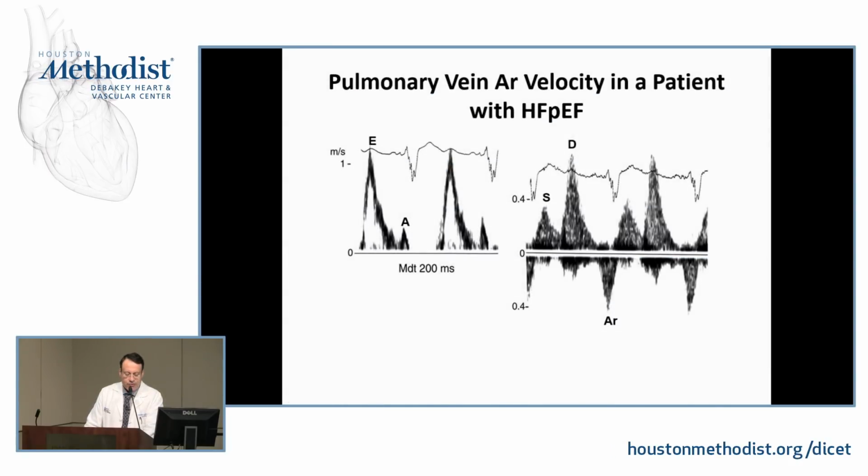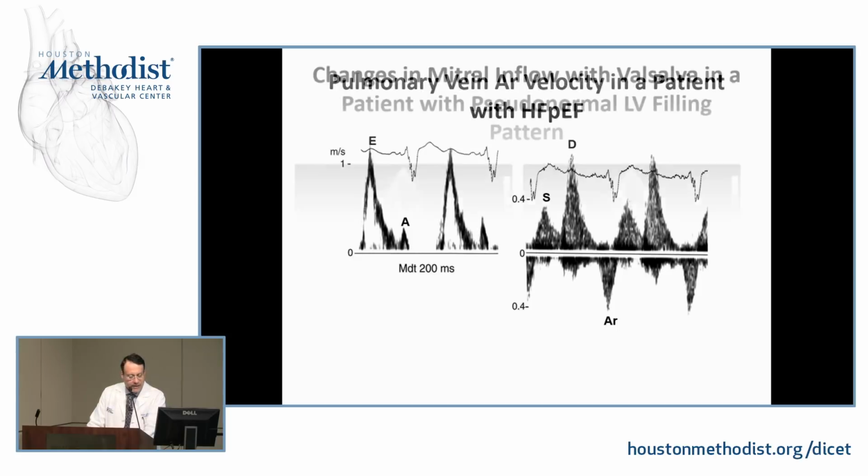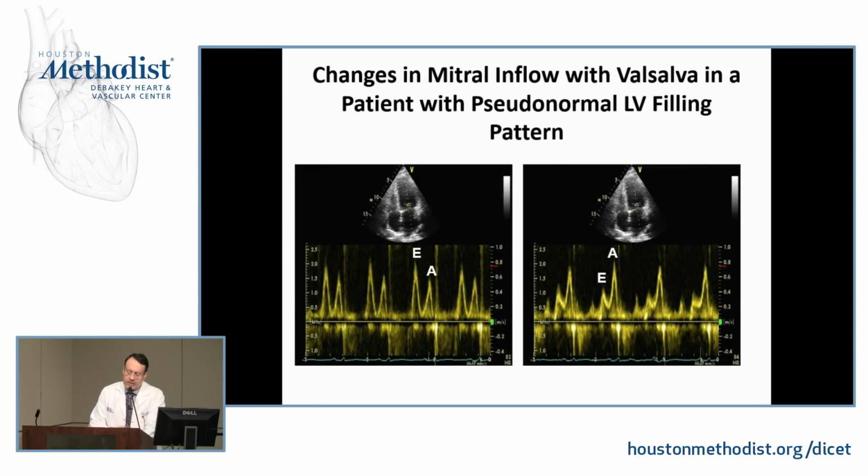How feasible is it to get these velocities if you spend enough time, particularly in the outpatient setting? The consensus of what is published in the literature from reputable labs is in excess of 80%. ICU yield is much lower.